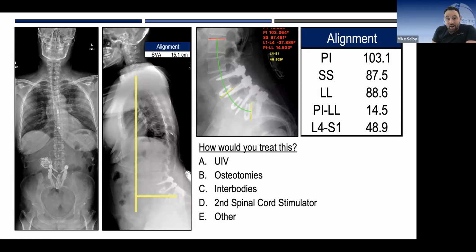And look, I would definitely be looking at some sort of osteotomy, probably combined with interbodies going up, and trying very hard because the disc at 1-2 seems to be okay. So maybe not taking this all the way up if I can get excellent alignment through what's been done via an osteotomy, pelvic fixation, and maybe an interbody at 2-3, a nice, really lordotic one, because those are all fused. And so it's going to be hard to get this back now. And maybe we have to actually change the patient's PI here to try to get this right. That's just my thoughts.